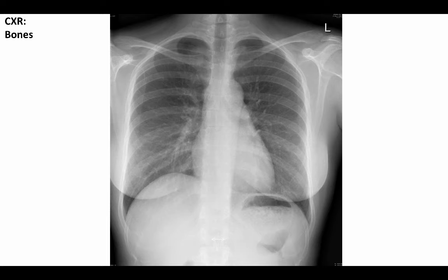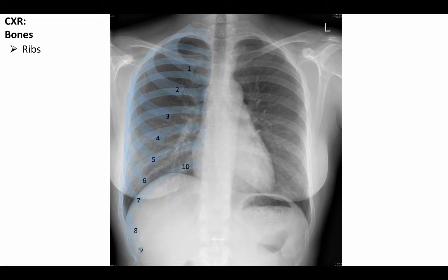Next we will examine bones and soft tissue. The first rib, which we can see here, is short, atypical, and broad. The superior 7 ribs are the true or vertebrosternal ribs, which attach to the sternum via their own costal cartilage. The 8th through 10th ribs are the false or vertebrochondral ribs, which attach to the costal cartilage of the rib above. The remaining two ribs are the floating ribs. The scapulae are usually very protracted due to the positioning of the patient during imaging, so that they do not obscure the lung fields.